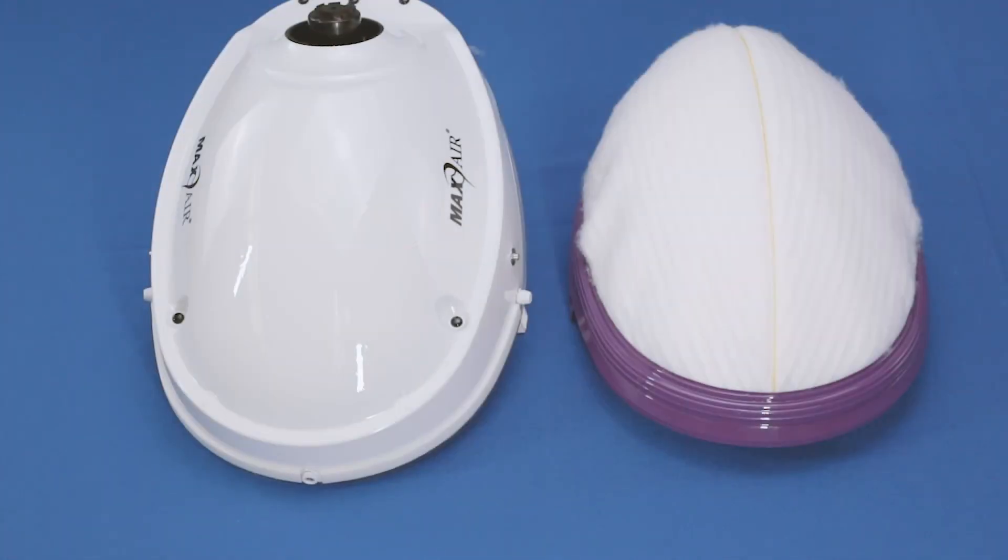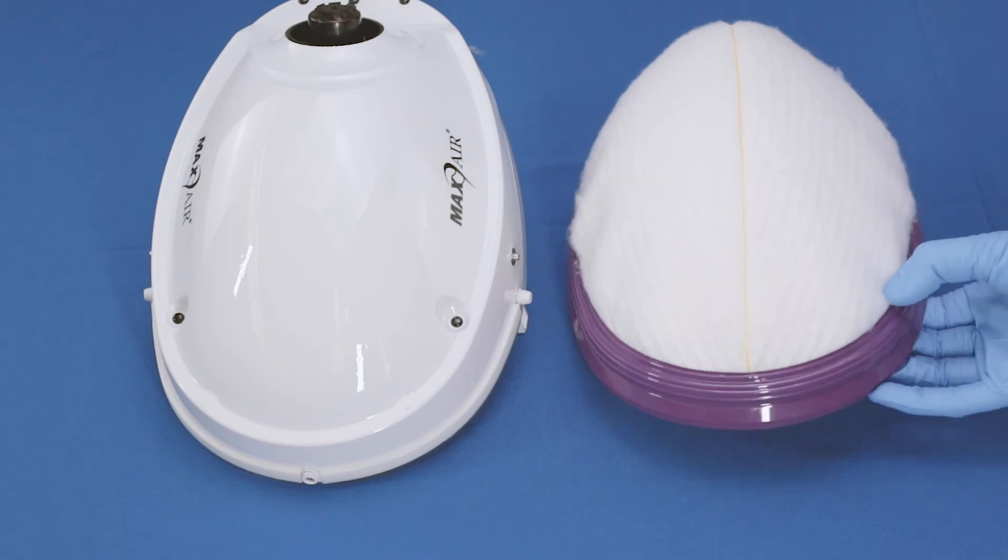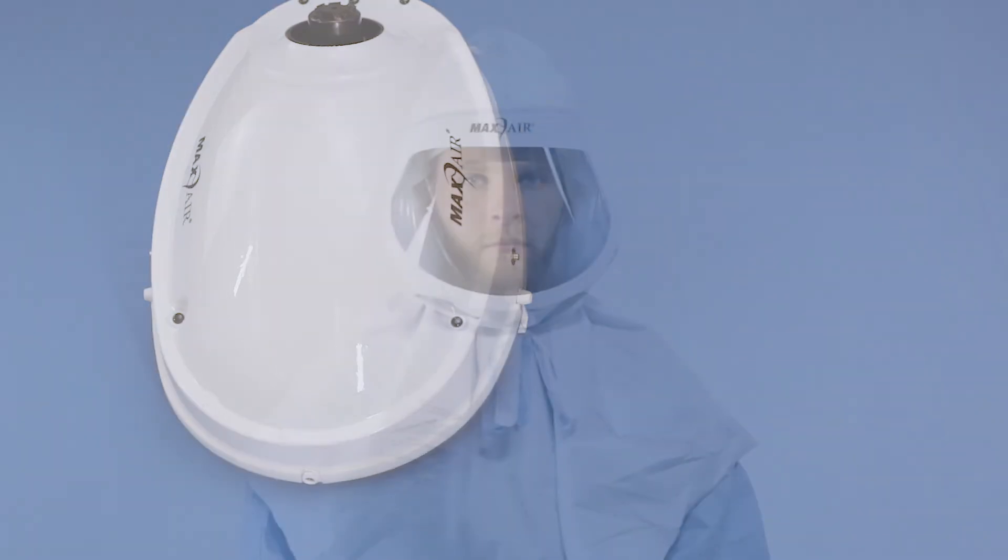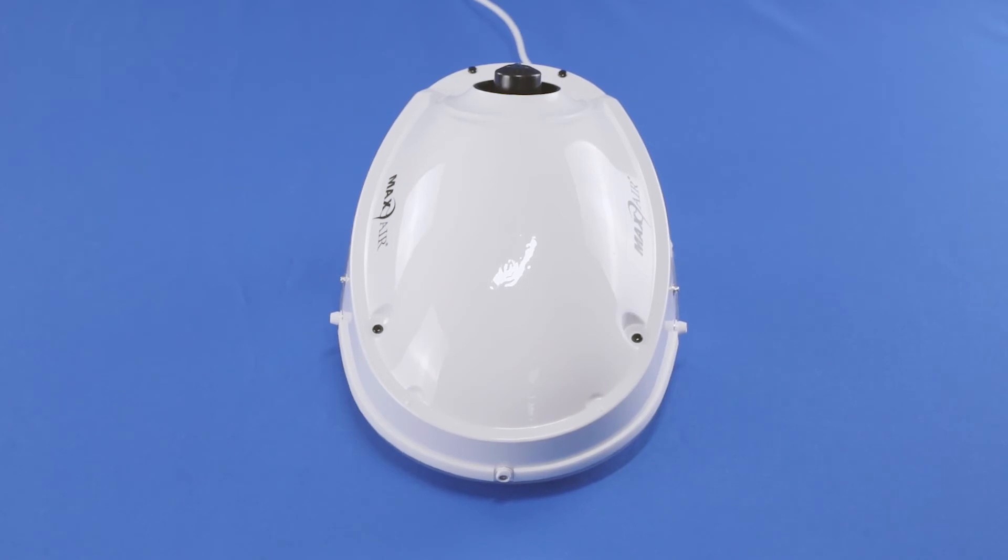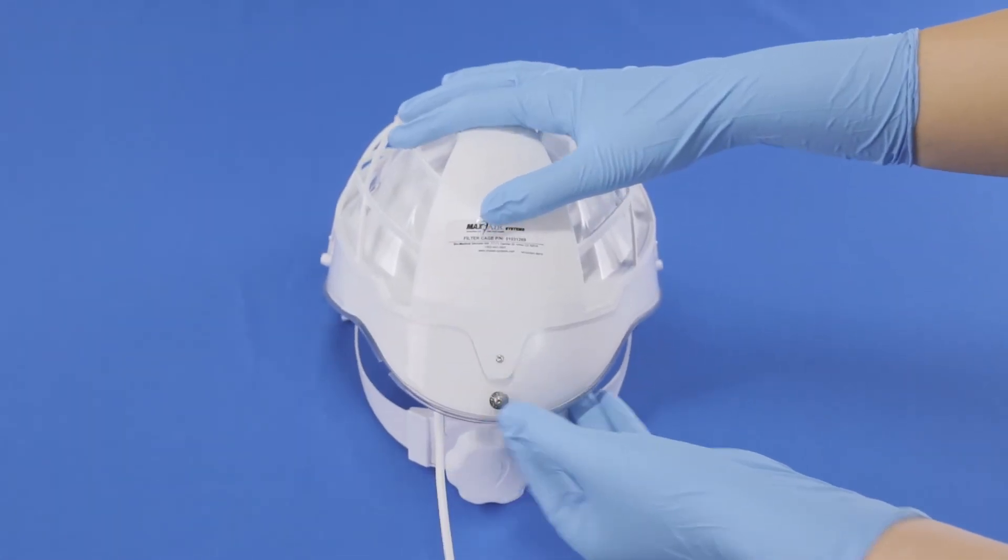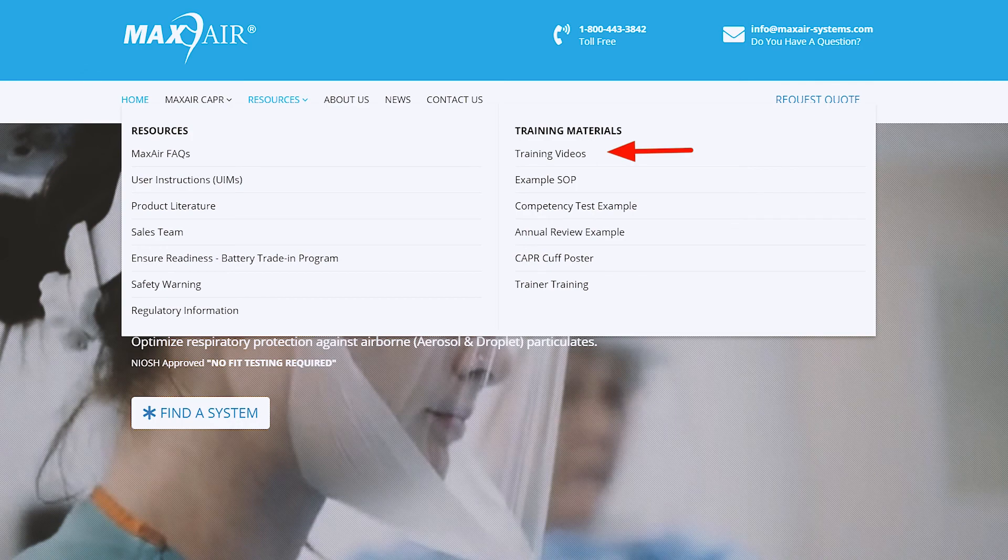Store it appropriately or dispose of it per your institution's protocol for contaminated waste. If you need to use the helmet with a hood or store the helmet without the filter cartridge, assemble the cage to the helmet. Refer to the helmet cage training video.